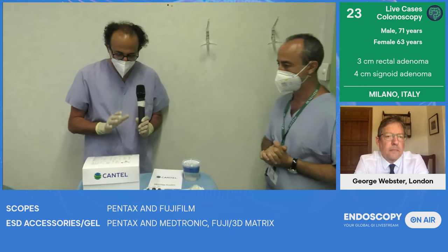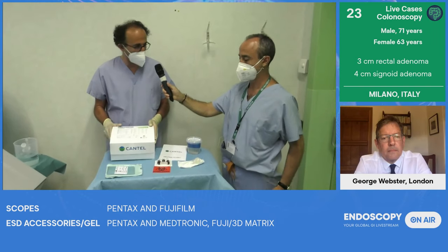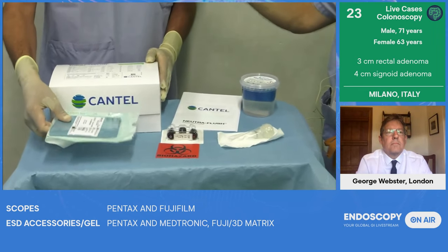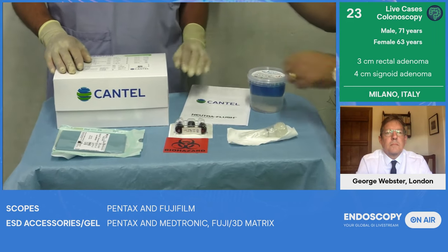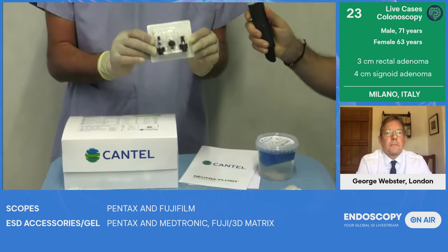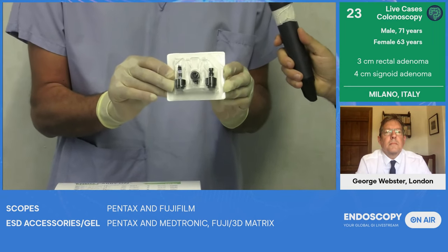Yes, Alessandro. Here, everything is single use, consumable. This is a procedural kit that is different between upper and lower endoscopy. When you open this kit, you have inside this sterile pad for the patient. You have the lubricant, the soap for the pre-cleaning, and another pad for the scope. But this is really special, Ale, because this is something that, at least in Italy, we know quite little. This is a single-use valve that is extensively used in the UK and in Germany.